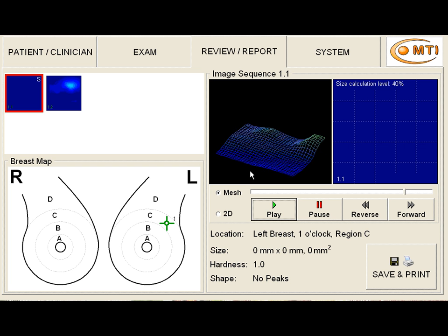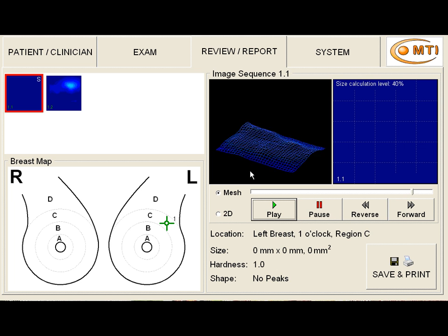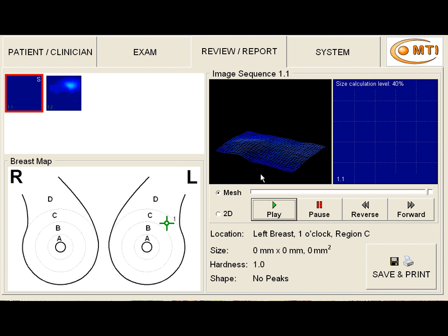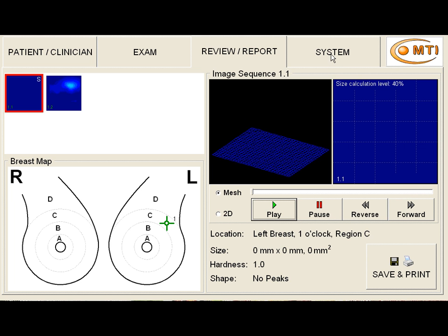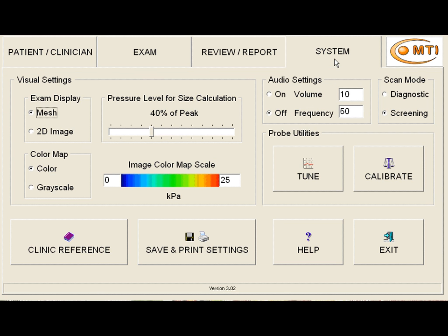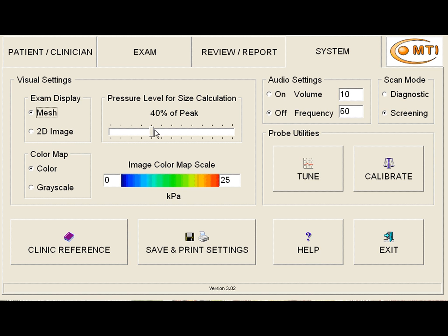And one thing that we might have done at the very beginning would be to look at our settings. So if we go back up to the system in the top right and we click on that, we note that our settings are set appropriately. If a mass developed, we would use the 40% of peak calculation, which would give us a good approximation of the size of the mass.